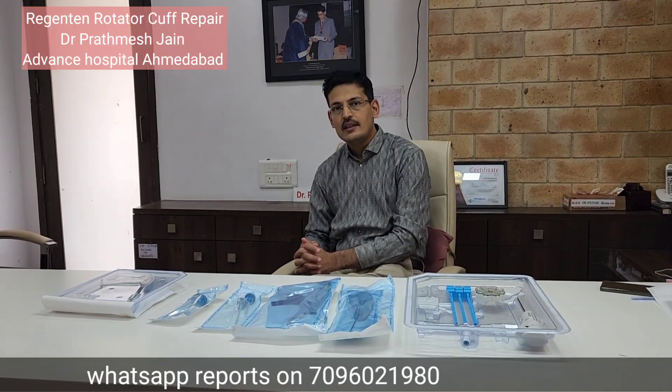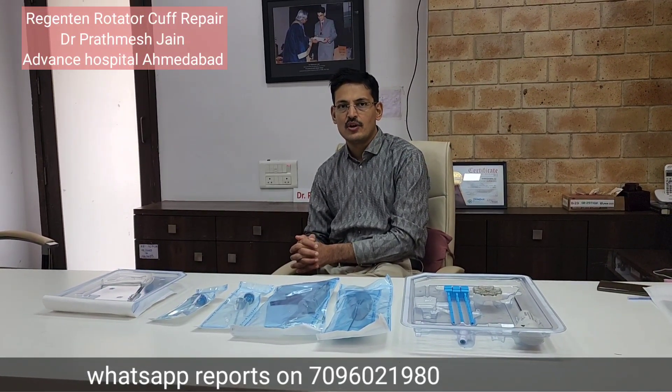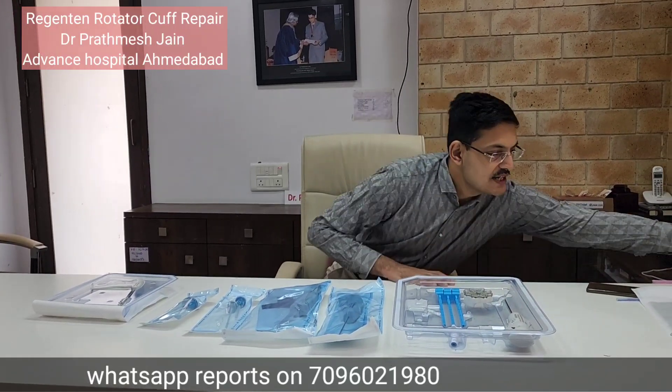There are two main indications. The first indication is when you are doing a rotator cuff repair and you want to add biology to it, ensuring that the retear rates are good and recovery is smooth. The second indication is to do a partial rotator cuff repair. In both scenarios, this device is one of the best available.